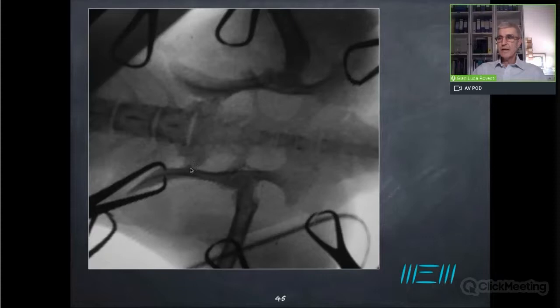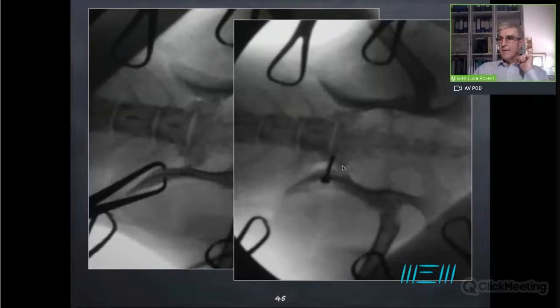Usually it is cranial and dorsal, the ilial wing. So with this Tip-it forceps, we can perform the reduction. And once we have achieved the reduction, I like to stabilize with a compression screw. That means I perform a bigger hole here on the ilial wing and a threaded hole here on the sacral process. I perform the hole and the thread on the sacral process, viewing it simply by moving the ilial wing so that I am able to see the white area where I should perform this threaded hole.